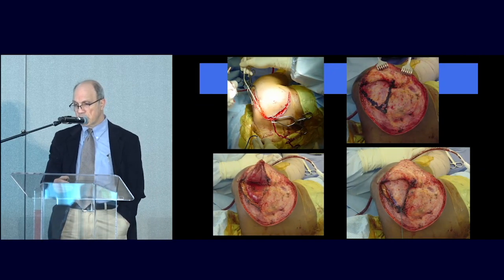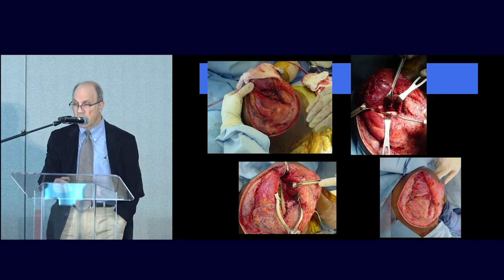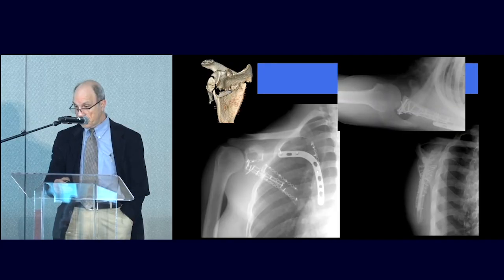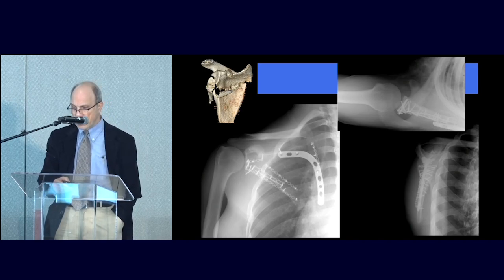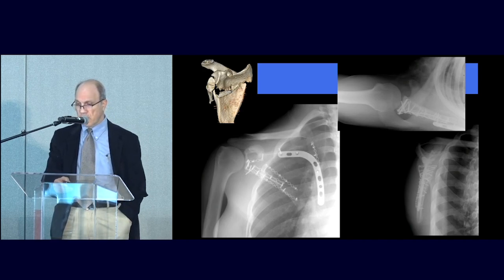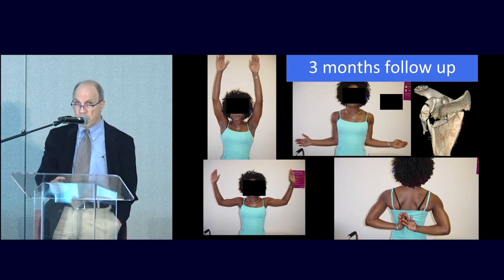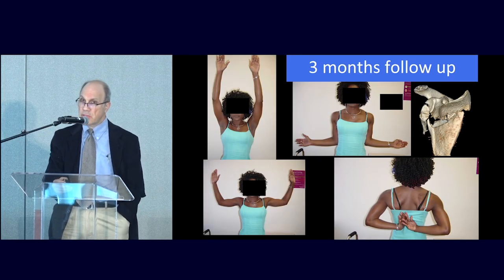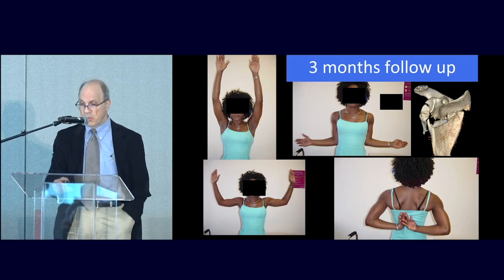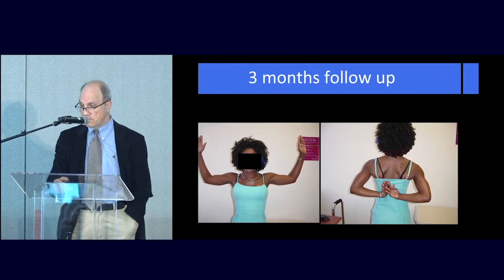This was the classic Judet incision, a modified Judet, again not reflecting the whole thing. This is reflecting the deltoid first, but not reflecting the infraspinatus, using the infraspinatus teres minor interval. This was an older plate. I don't use the big plates anymore. I use just 2.4, 2.7 plates, but it worked well for this patient. I think I improved the quality of the reduction of the joint quite a bit. And these patients, to tell the truth, recover significantly better than you would think with this kind of big approach, raising the big flaps and all kinds of things. If you select the right patient, a young patient, more motivated to want to go back, they recover pretty well and pretty quickly, including the pain too.